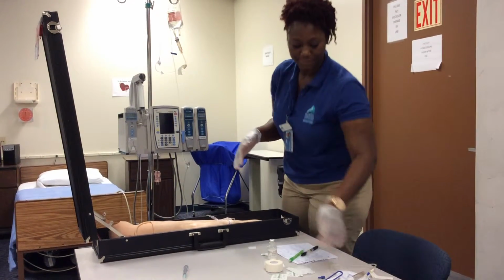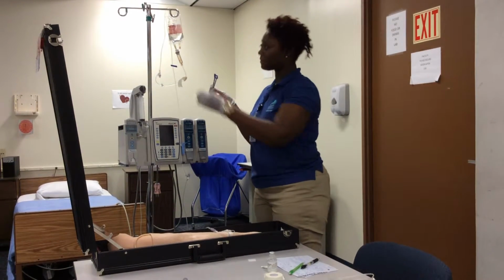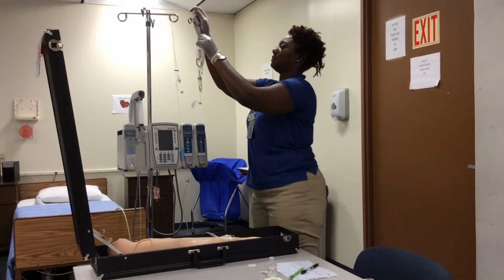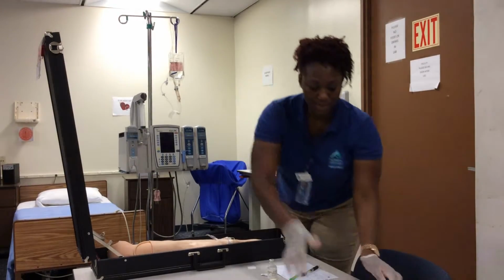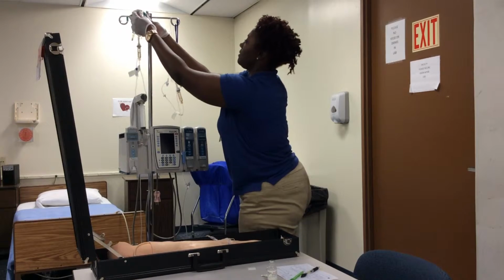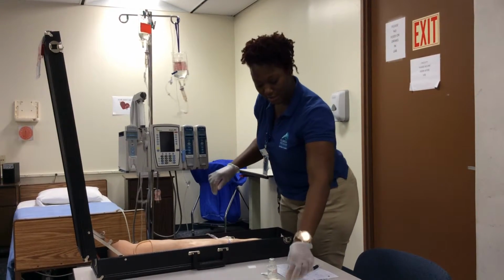Alright, and I'm going to assume that the line is still patent. Alright, so now I'm going to lower my primary, and I'll hang my secondary. So now I'm going to clean up the port.